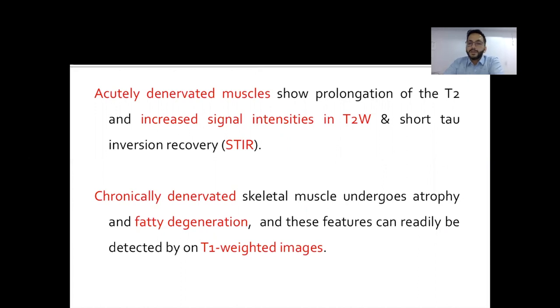So acutely denervated muscles show prolongation of T2 relaxation time. There will be increased intensity on T2 and STIR images. The muscle volume is relatively maintained. Whereas in chronically denervated skeletal muscles, there is atrophy and fatty degeneration. And these muscles show increased intensity on T1 images.